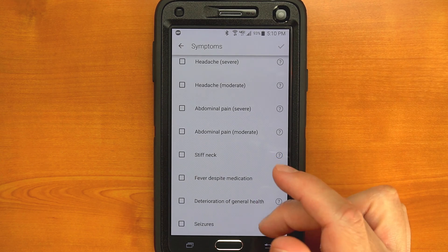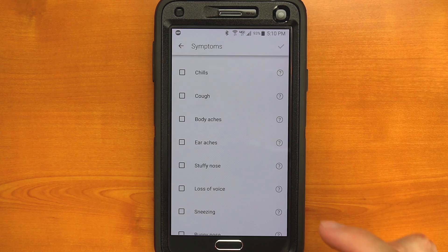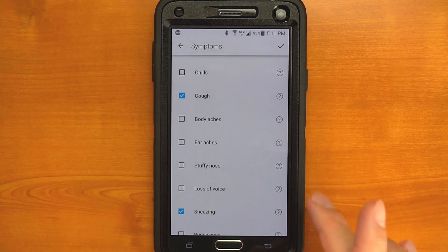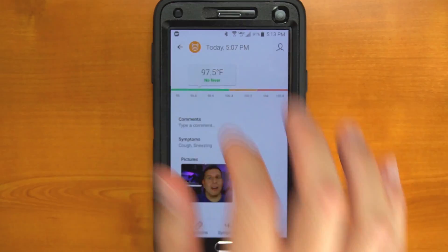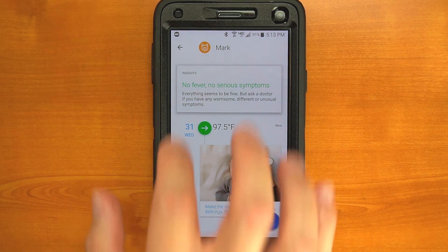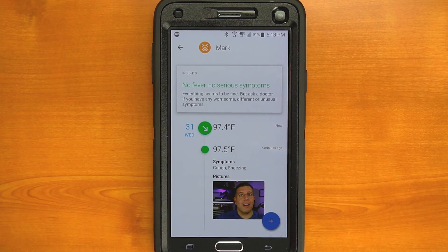The Thermo is FDA approved and has a resolution of a tenth of a degree, so this is a real, legit medical device. If I was to summarize what the killer app of the Thermo was, I'd have to say it's the ability to take a reading in two seconds without having to make contact with the skin, which is pretty cool. You can actually hold it about half an inch above the surface of the skin and still get an accurate reading.